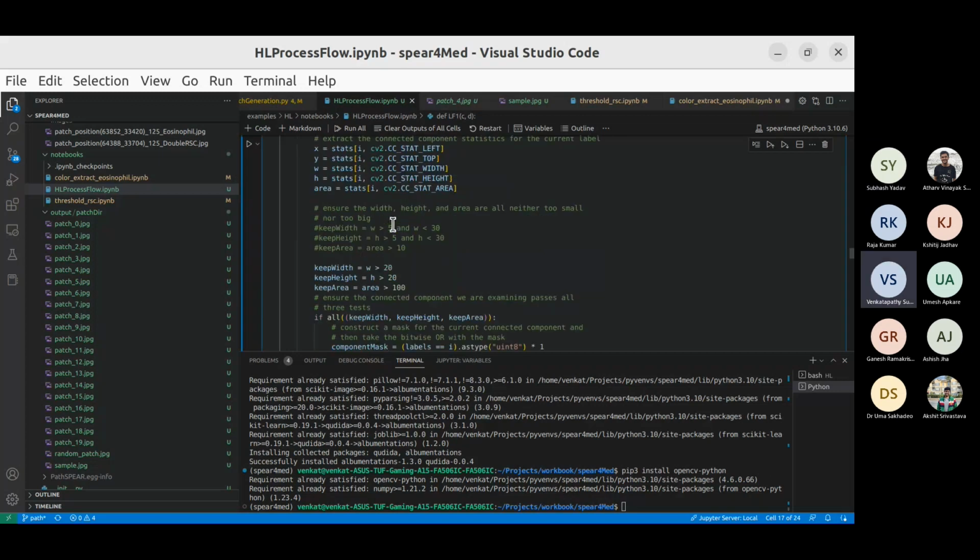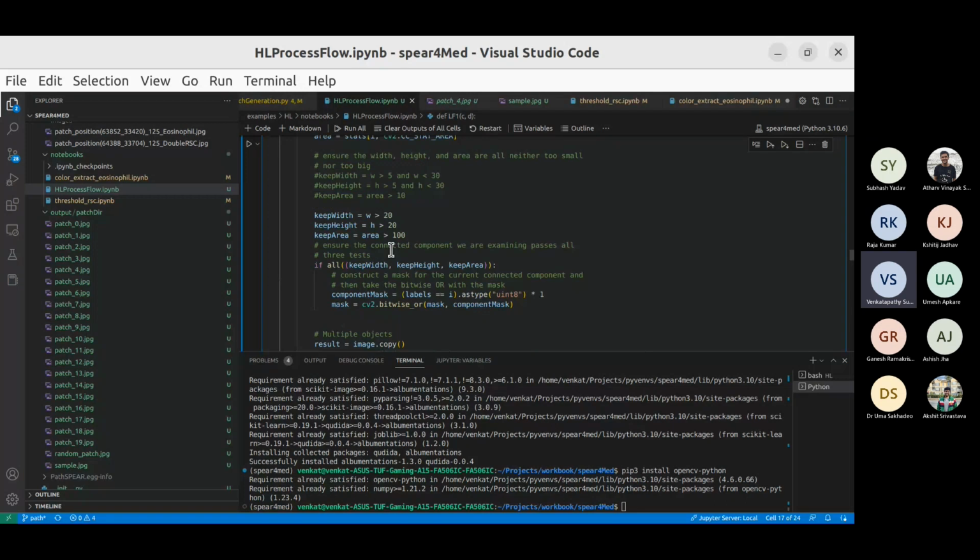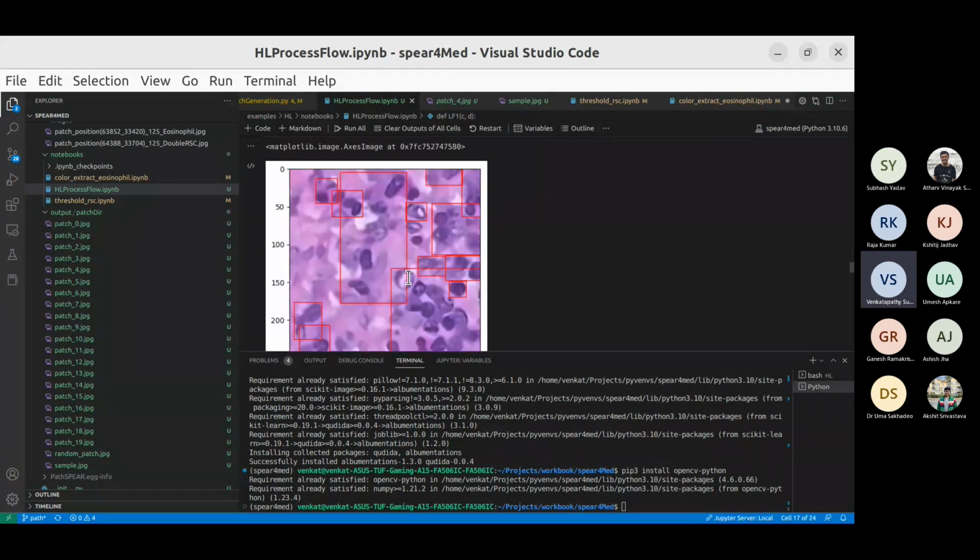These are computer vision techniques applied even for face detection and object detection, but we are also applying it here with some of the knowledge that you gave, if you remember the document that Umesh shared, that was really useful. Based on that, we are doing it. Before applying it to Hodgkin lymphoma, we are also applying it to open datasets. One of the datasets is LIS2.